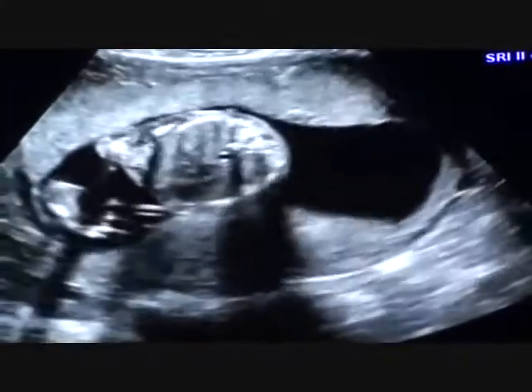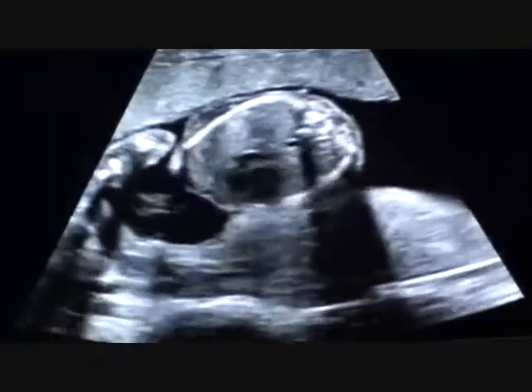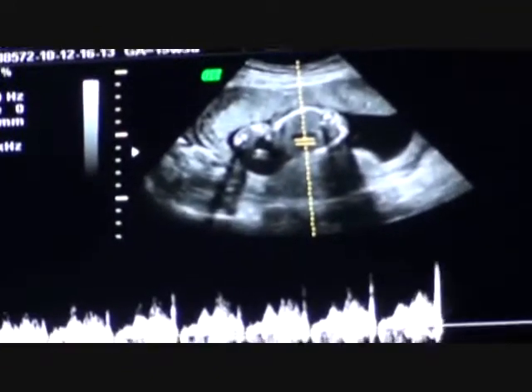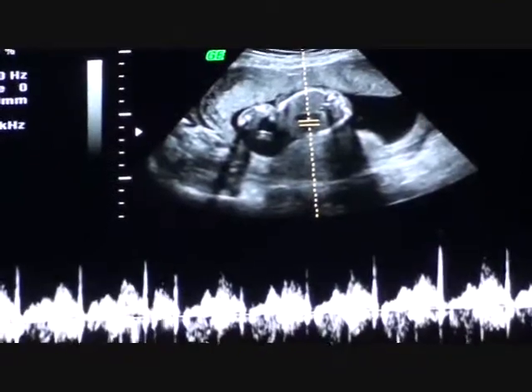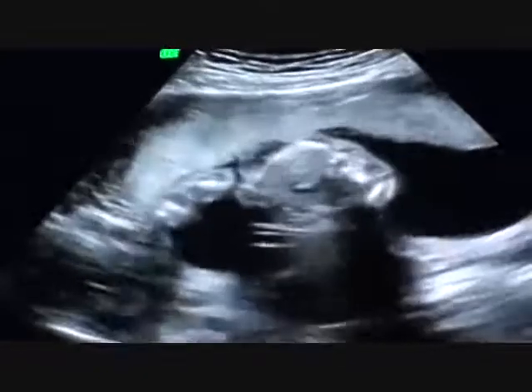Need his heart — looks like he turned a little. I like to make sure there's four chambers in the heart. Kind of need him to turn a little bit in there so we can get it better. Nice little heartbeat — 158, which is perfectly normal.